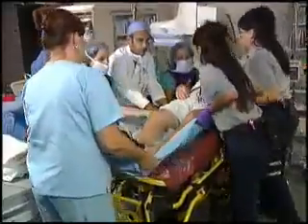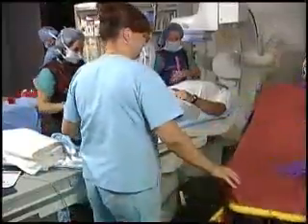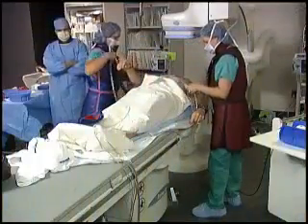Once the patient arrives in the cardiac catheterization suite, he is transferred onto an X-ray table while the cardiologist and nurse practitioner obtain a medical history focusing on issues related to the heart. They perform a physical examination and review the ECG and blood test results. The patient will be asked to sign a consent form for the procedure. The catheterization technician places heart monitoring equipment on the chest and a blood pressure cuff on the arm.